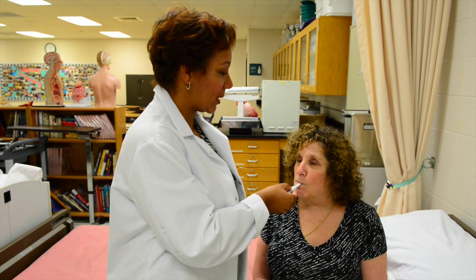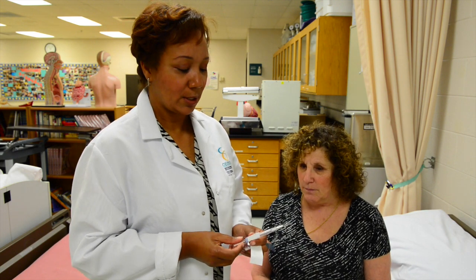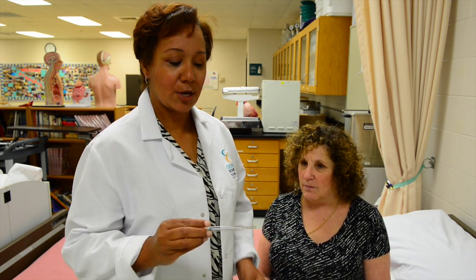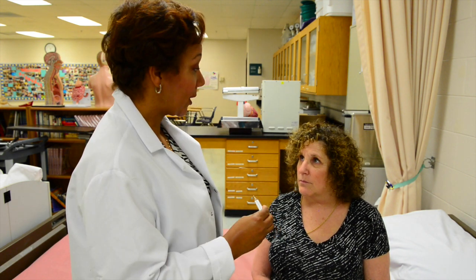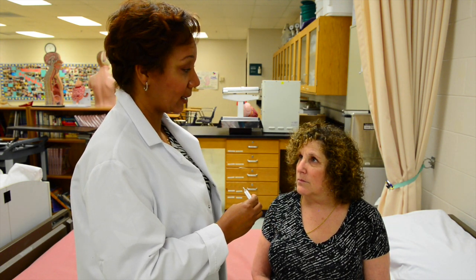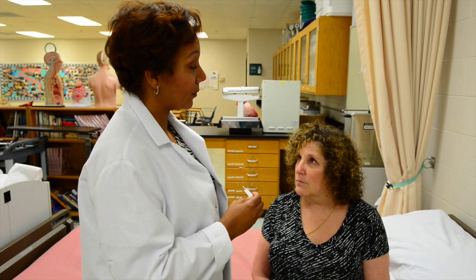After three to five minutes, you remove the thermometer from the patient, remove the sheath, and you will read the temperature. Ms. Katzewicz, your temperature is 102.6, which appears to be abnormal. We're going to run further tests.